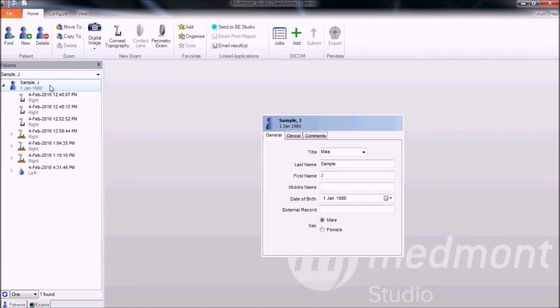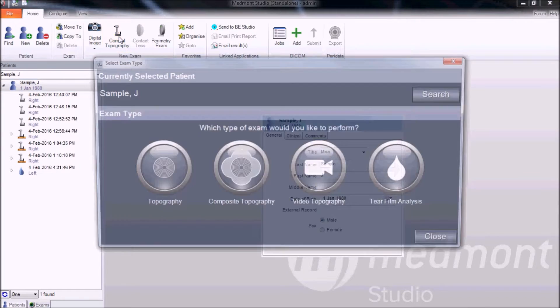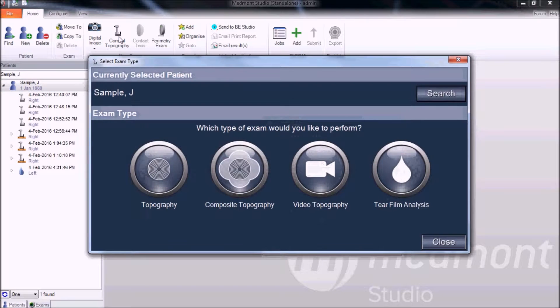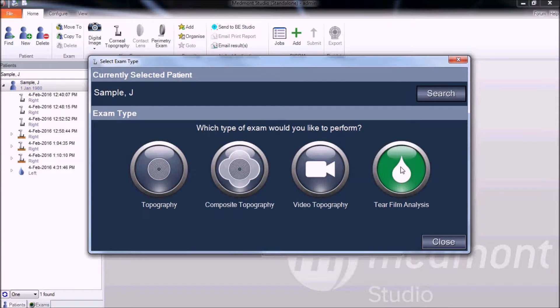Start by clicking on the patient name that you wish to capture on. Then go up to the corneal topography capture icon, which brings up the exam window. From there, select tear film analysis.